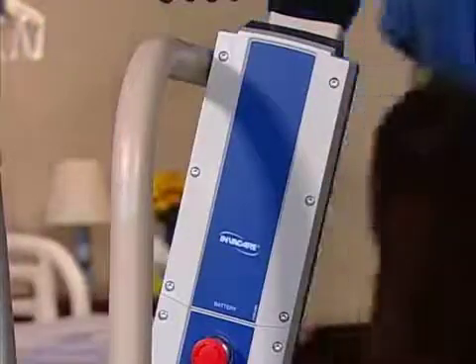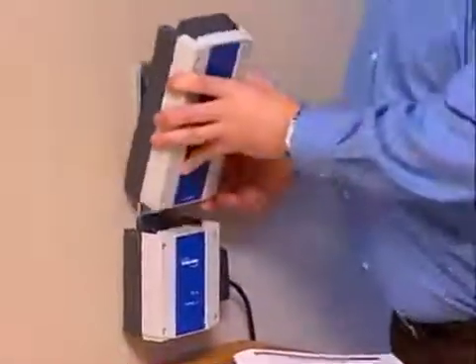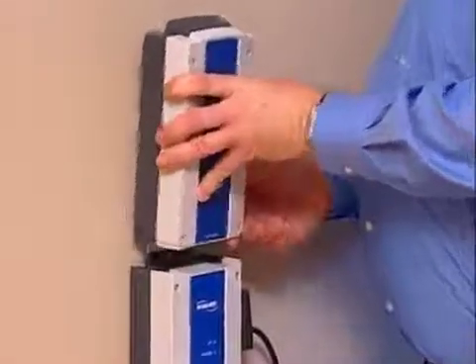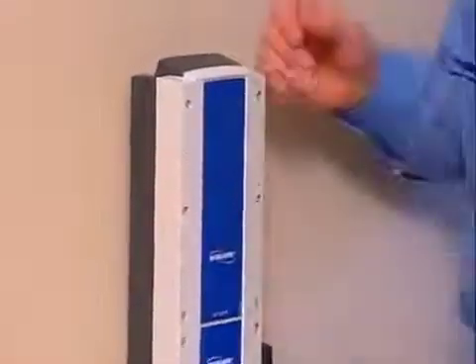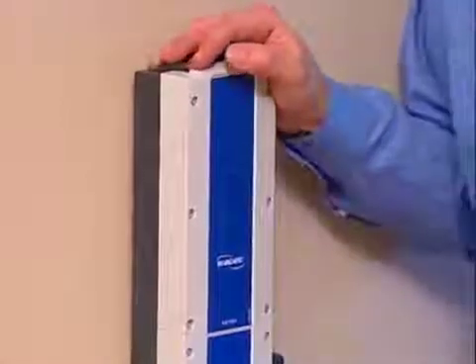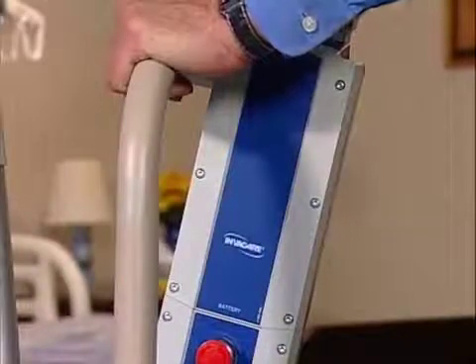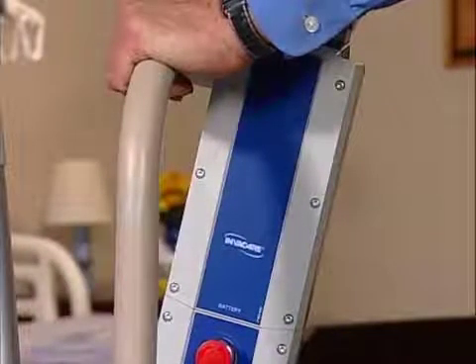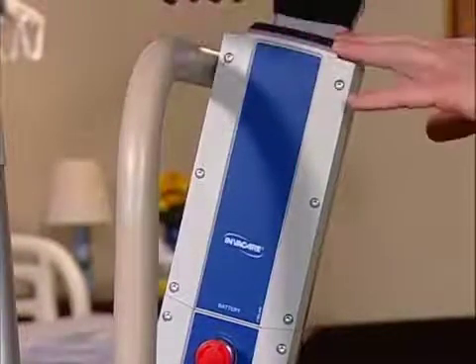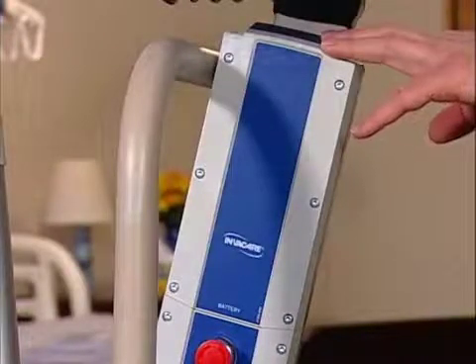Power for these lifts comes from a 24-volt battery. Each unit comes with 2, and a wall-mountable battery charger. So you can have one battery powering the lift while the other battery is on the charger. It takes about 4 hours to fully charge a battery. You can make about 200 lifts before a battery needs charging, and you'll know when it needs to be recharged because this alarm will go off when the battery is low.